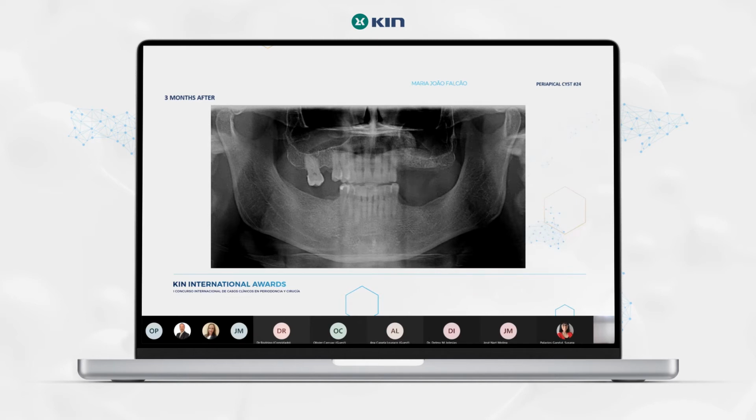It's everything okay. Here we already removed the roots and did the filling on the 45. And there is something I want to tell you about this patient. He told me that he has had sinusitis his whole life, and he needed to take pills for it, and it was quite aggressive in the last years. And after we did this treatment, he said that he stopped having the crises.